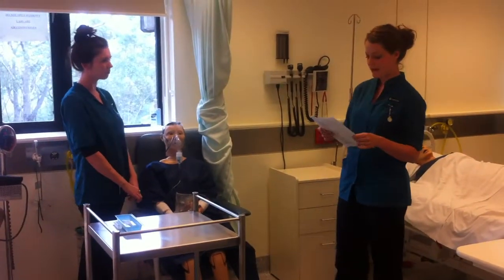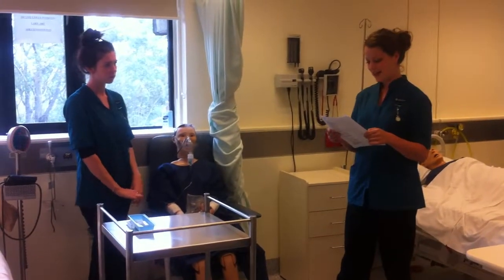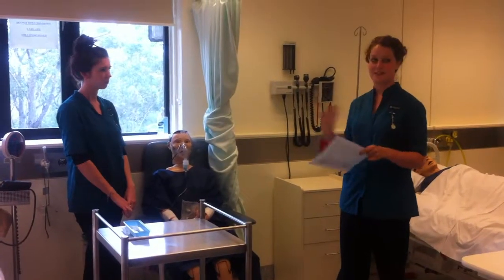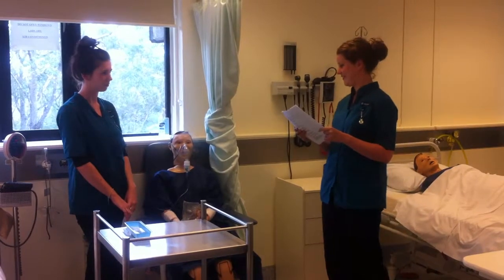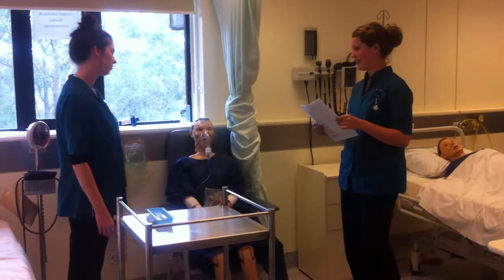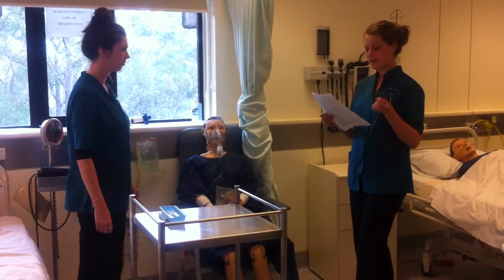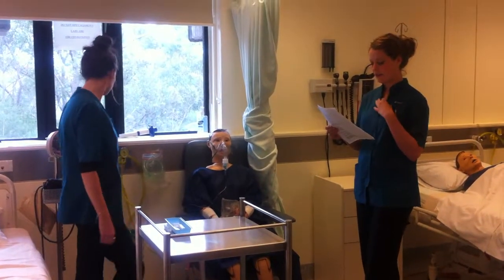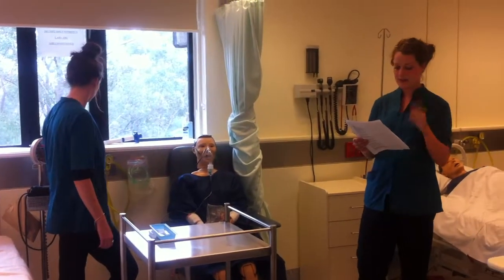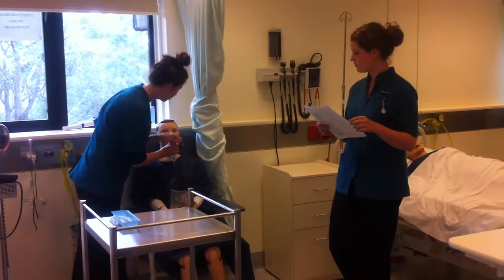With most nebulizers, 60 to 70% of the drug is wasted during the expiratory phase unless breath-assisted nebulizers are used, which this is not. So in this case, it's good to keep the mouth shut and not talk. Once the nebulization is done, it will spit intermittently, or there will be no further aerosol to be delivered. This will be no more than 10 minutes for bronchodilators. And then we'll just take this off, Mr. Saunders. Thank you.